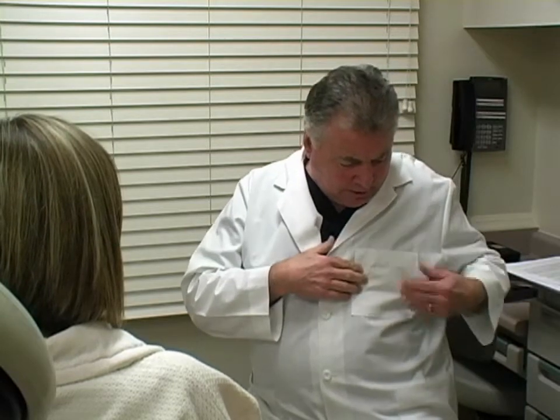So you'll find that as we near the end of this procedure, I'll say, Kelly, stand up, and let's take a look and see what you say. And you'll say, Dr. Keller, now that I stand up, I see there's a little bit more as I look down here. And I'll say, Kelly, I think there's a little bit more right here. And so that's the fine carpentry work that we're going to do, okay? Okay. So that's good.